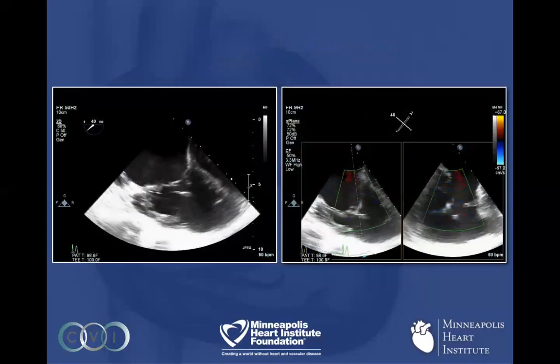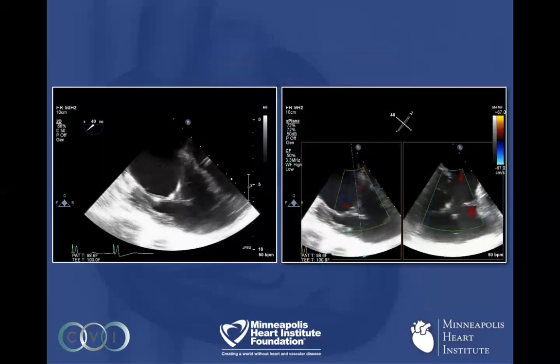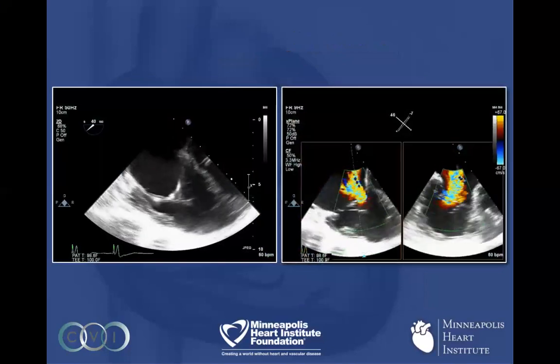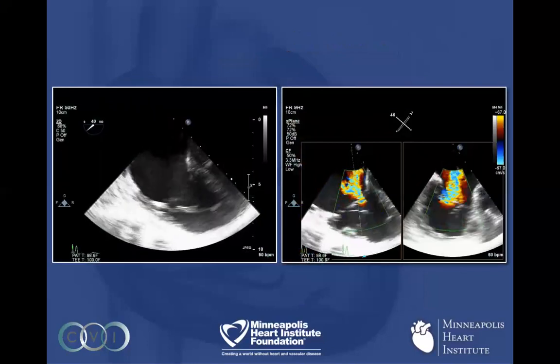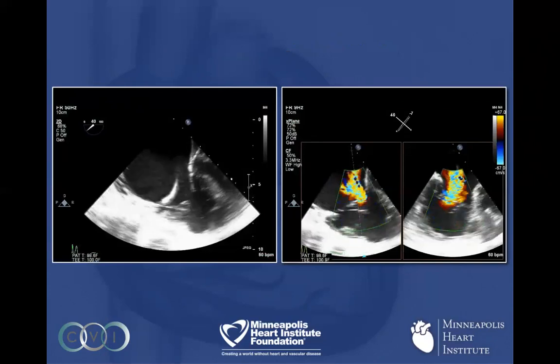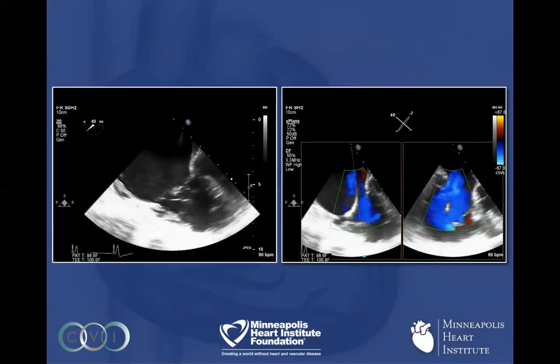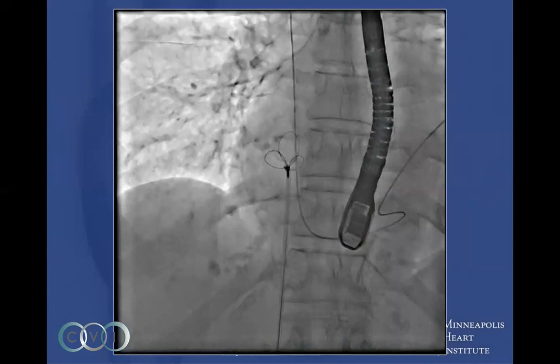Here are some transesophageal echocardiogram views. On the left-hand side, you can see the coronary sinus pacemaker lead with the lead falling into the right ventricle. There's also a considerable amount of TR, as you can see on the right-hand side. This is with TEE, with orthogonal views across the commissural planes of the TR. We then tried to see if mobilizing the pacemaker lead would help improve the TR.